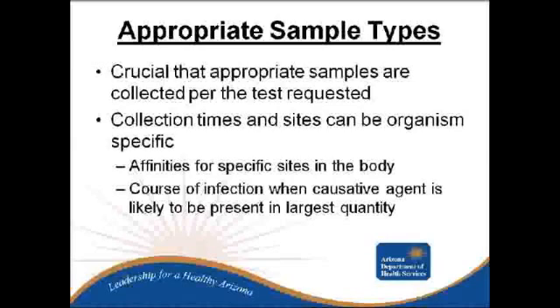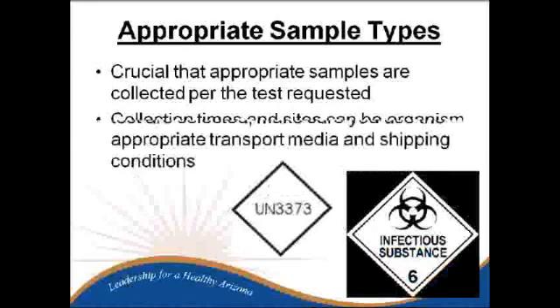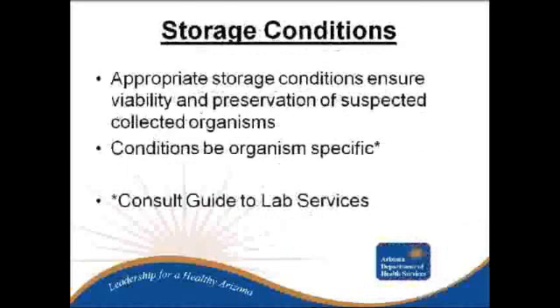And after you have chosen the appropriate sample, you need to make sure that you're shipping these things in the correct transport media and under the correct shipping conditions. So choosing the appropriate storage conditions really is essential to ensure that you're maintaining the viability of the organism and they're being maintained under proper shipping conditions when shipped.